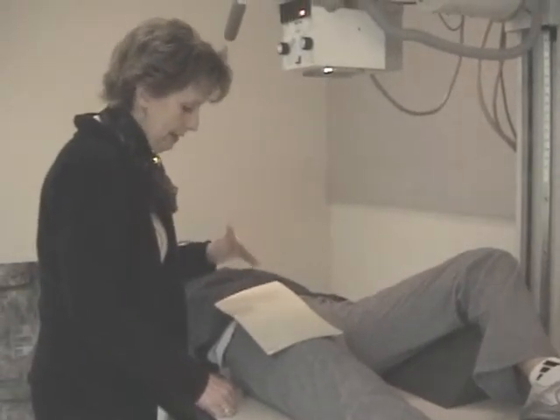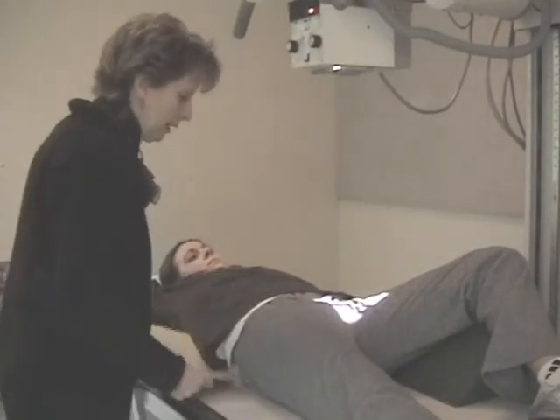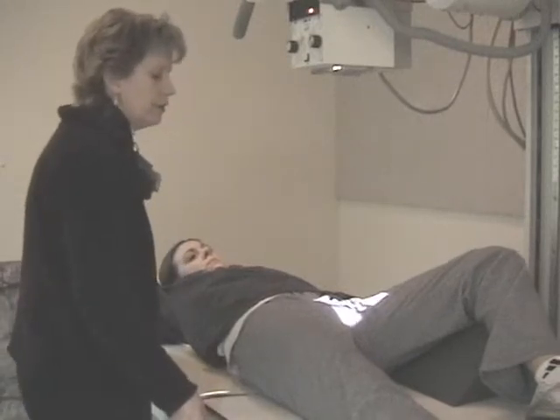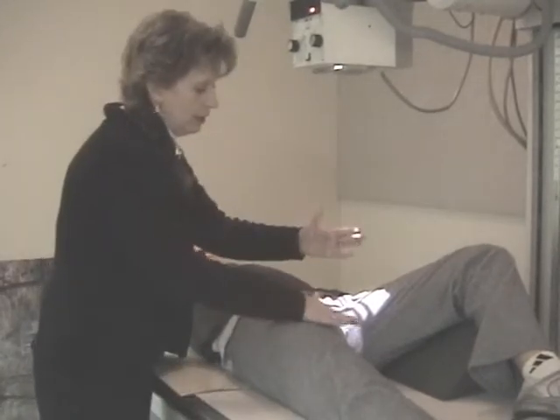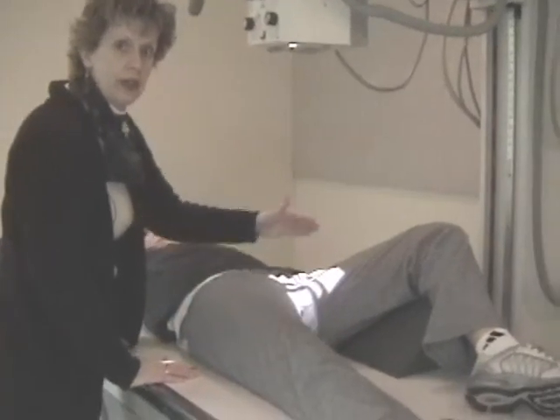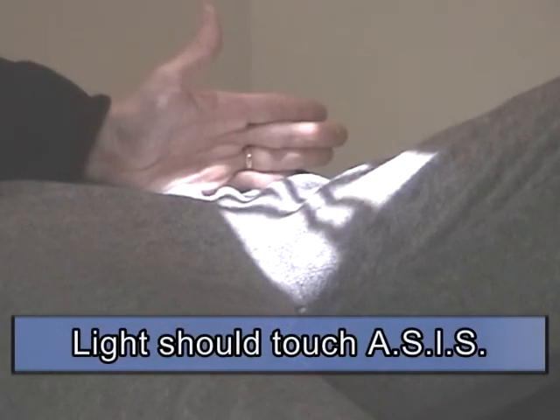I'm going to show you a trick now that might help you know that you're off. We're going to just kind of readjust here a little bit. Maybe the camera can come in a little different. Can you see the leg now in the camera in the shadow here? You can tell that here's the ASIS, and see how the light is below the ASIS? And see how the light is hanging down on the table? That should be an indication to you that you are too low. You want to have the light touching the ASIS, so you'd make that adjustment.